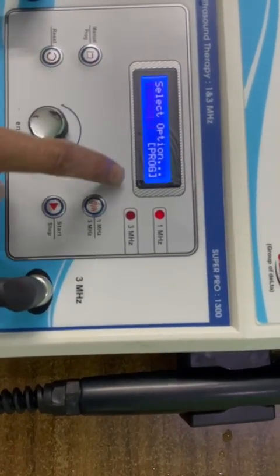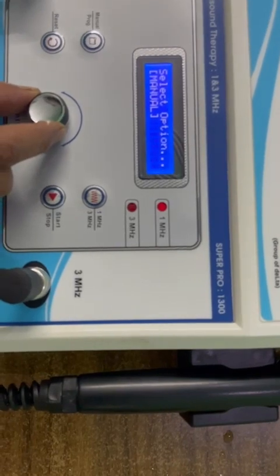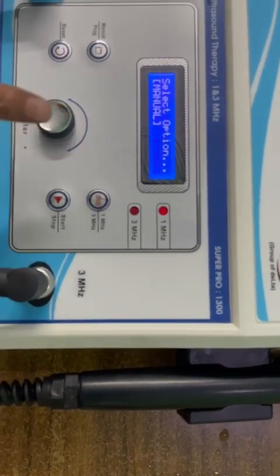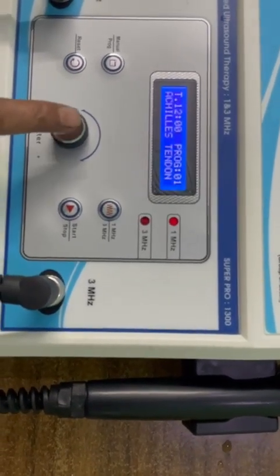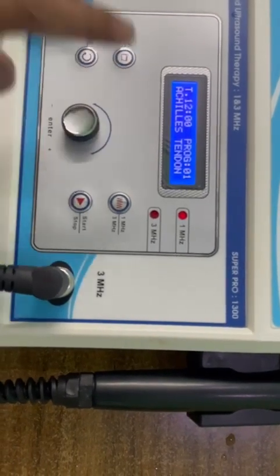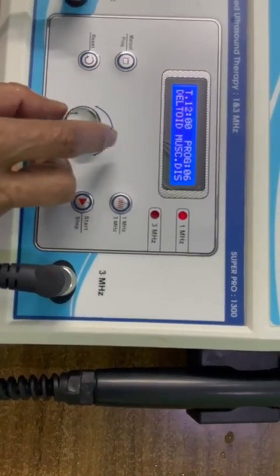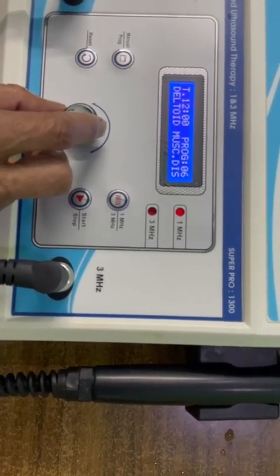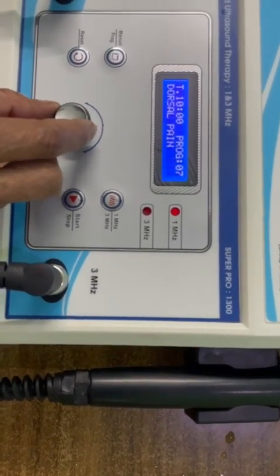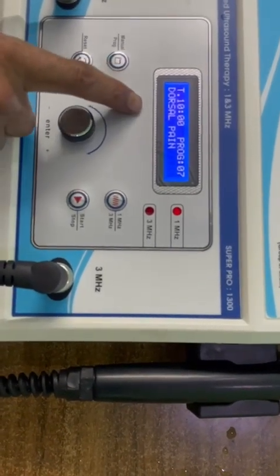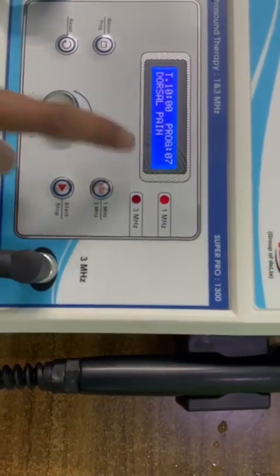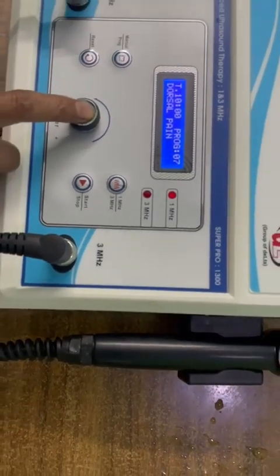Manual mode blinking. Now we can set it to program. Now program mode is blinking. Press it again. It has 30 programs. You can change the program as per your requirement. We set it dorsal pain, program number 7. Press it again.